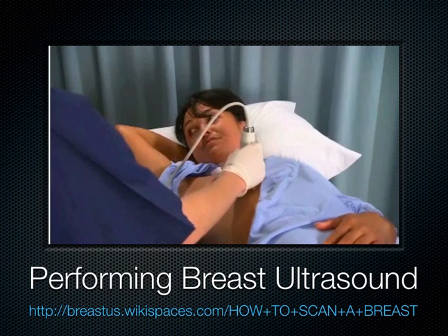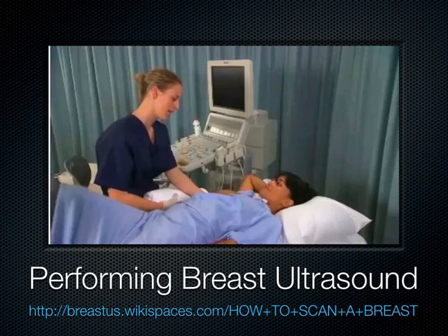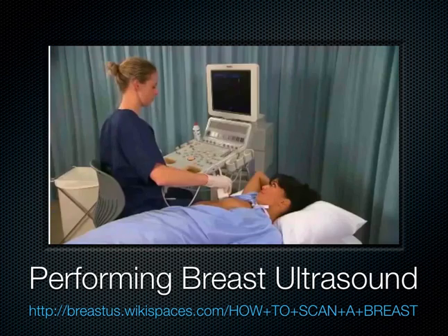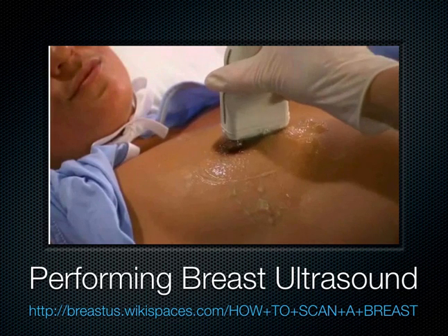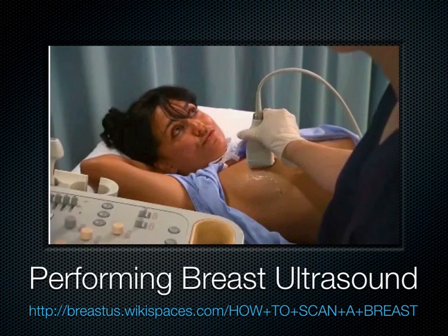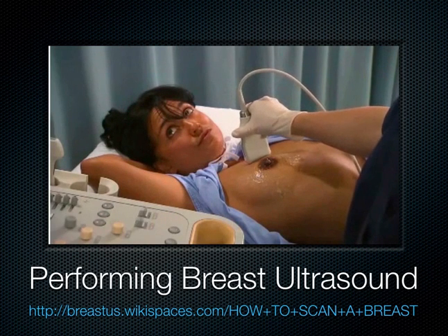Scan the inner aspect of the breast or medial quadrants in the supine position with the ipsilateral arm raised above the head to maximize the image quality. Roll the patient into the supine oblique position to scan the outer aspect of the breast or the lateral quadrants. Scanning the breast in the radial and anti-radial planes is exclusive to breast ultrasound. The radial imaging plane is arranged in a wagon wheel pattern with the nipple at the center. The radial plane is parallel to the ductal system and is extremely useful for detecting ductal lesions. The anti-radial imaging plane is oriented 90 degrees to the radial plane and perpendicular to the ductal system.